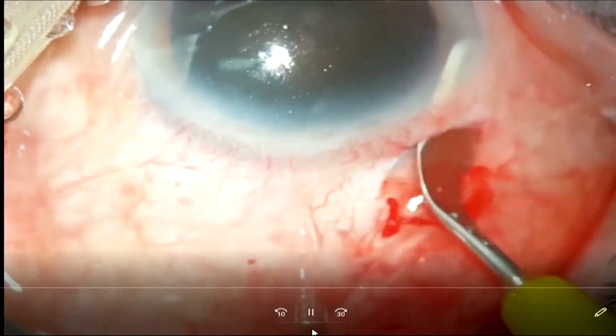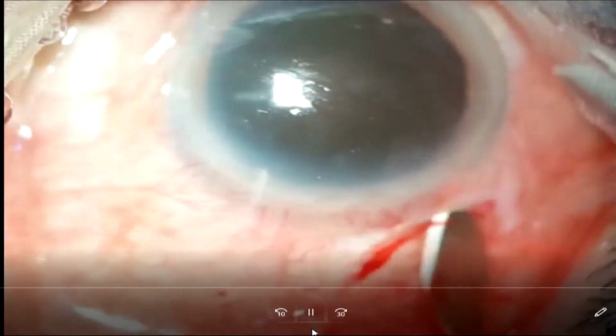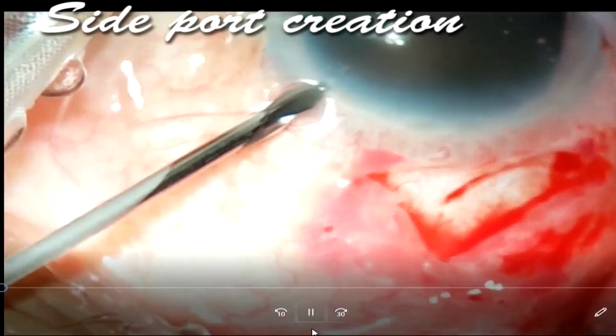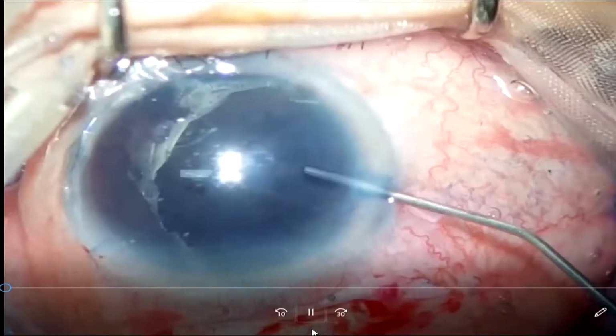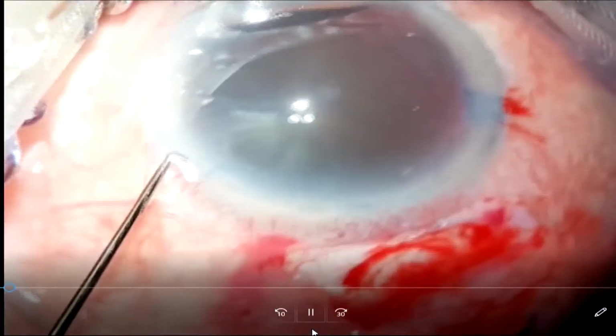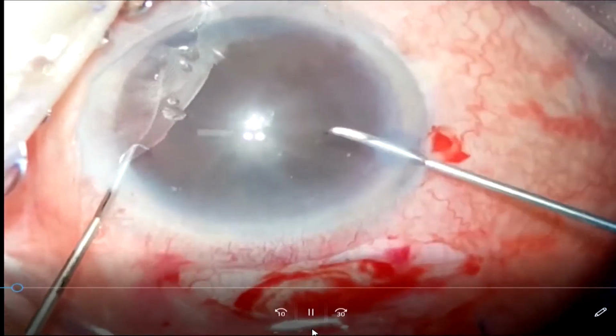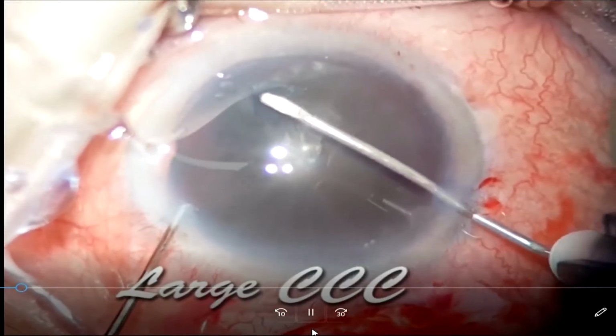It is very important to use blades that are sharp, otherwise you don't have a very good dissection. I create 2 side ports nowadays instead of 1. It helps in stabilizing, especially if you're trying to do a topical. And this is the rhexis.